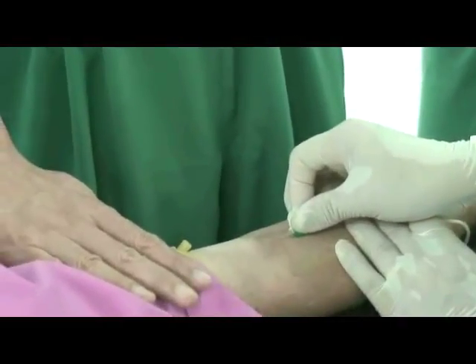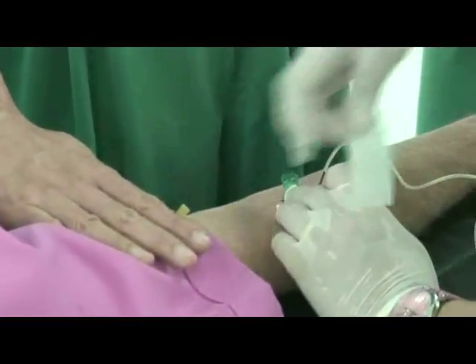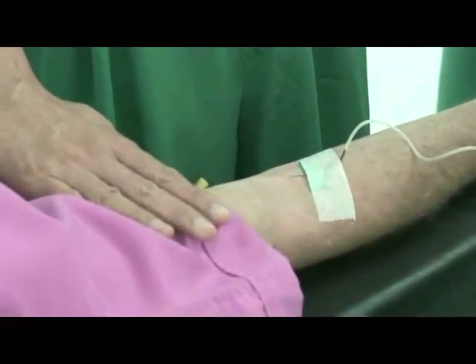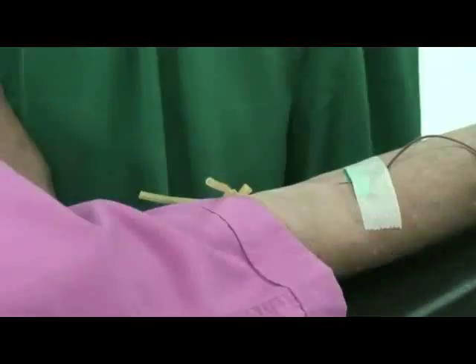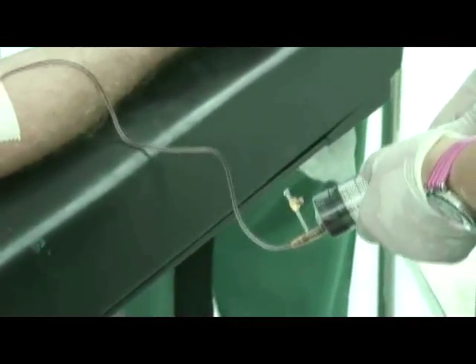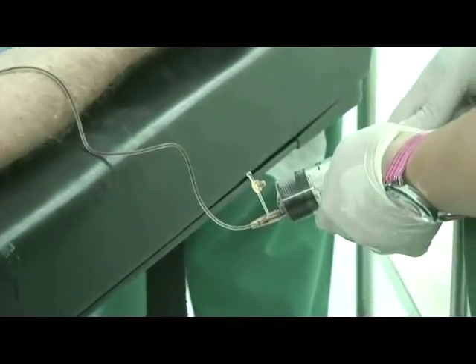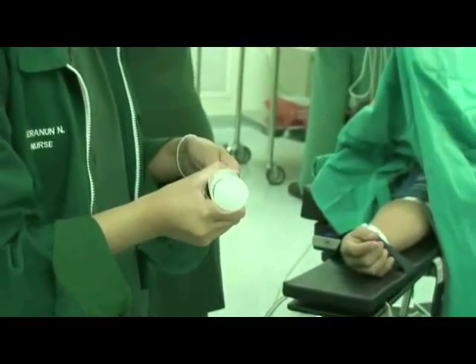To begin the PRP procedure, draw 50 cc of blood from the patient into a syringe. Inject the blood from the syringe into 6 blood collection tubes provided in the ADDI-STEMS PRP kit.